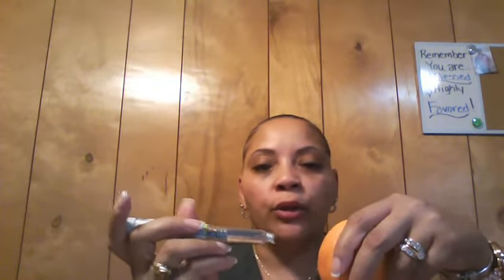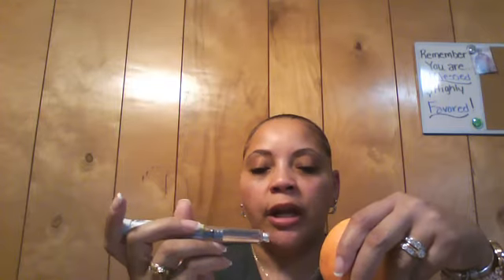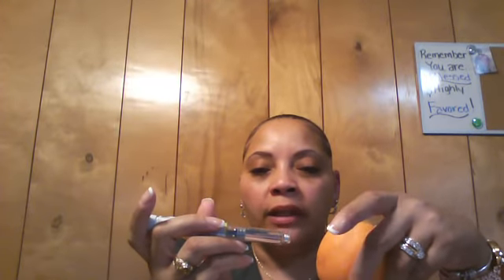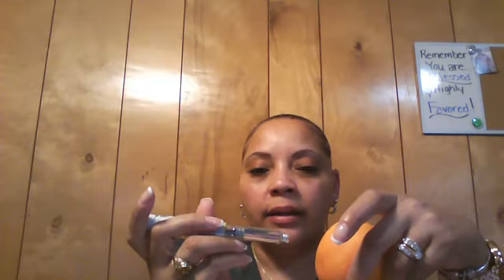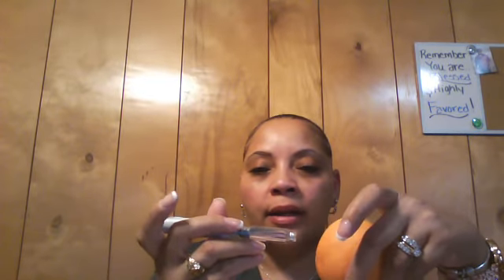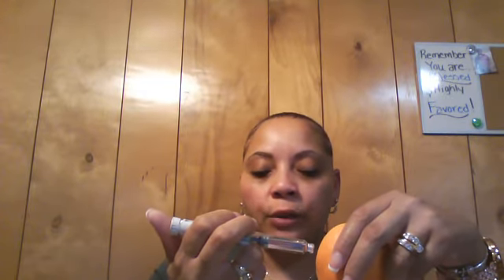It is going to be a little pinch. I'm not going to lie to the patient, say it doesn't hurt. It's a little pinch. I go straight in at a 90-degree angle. I release the skin, steady my needle with my non-dominant hand. Once I release the skin, I go straight in, and then with my dominant hand, I press in the dosage of the insulin very slow.